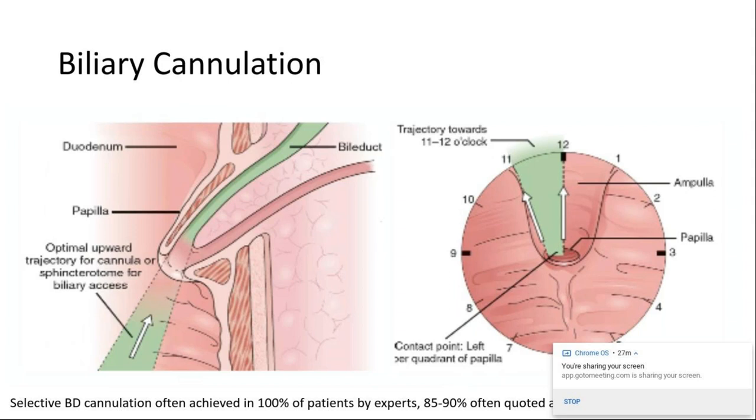The catheter or tome should be flushed and primed with contrast to remove any bubbles prior to insertion into the scope. Air mixed with contrast injected into the biliary system can mimic stones. It can also cause more serious pancreatic injury due to overdistension. And when you try to flush contrast in the duodenum to prime the catheter, it can cause duodenal motility and obscure visualization of the distal bile duct.